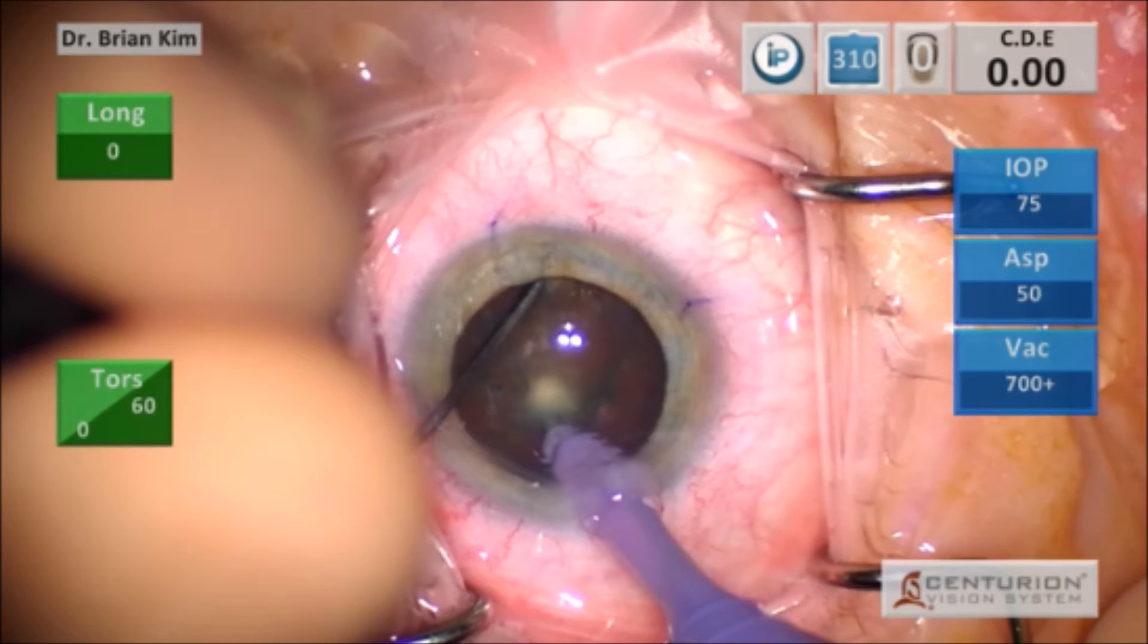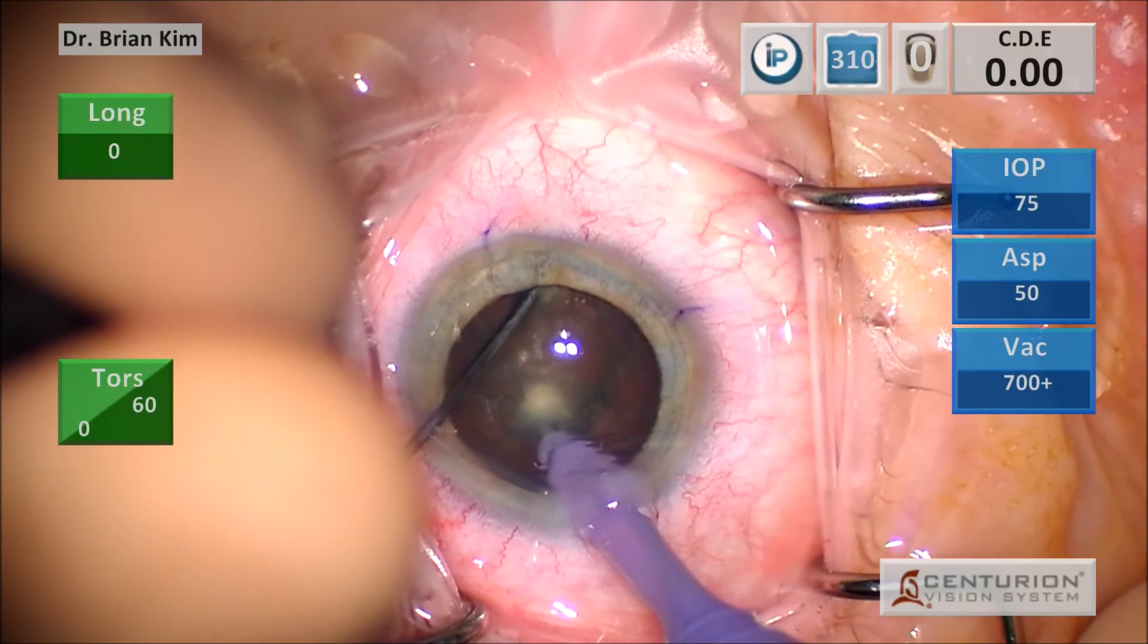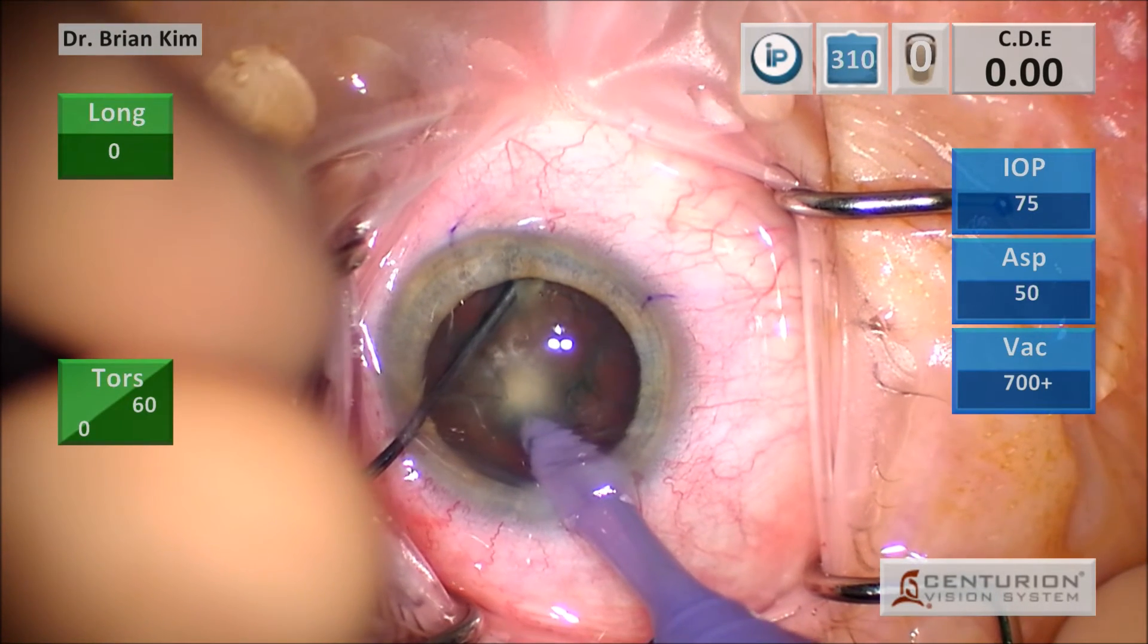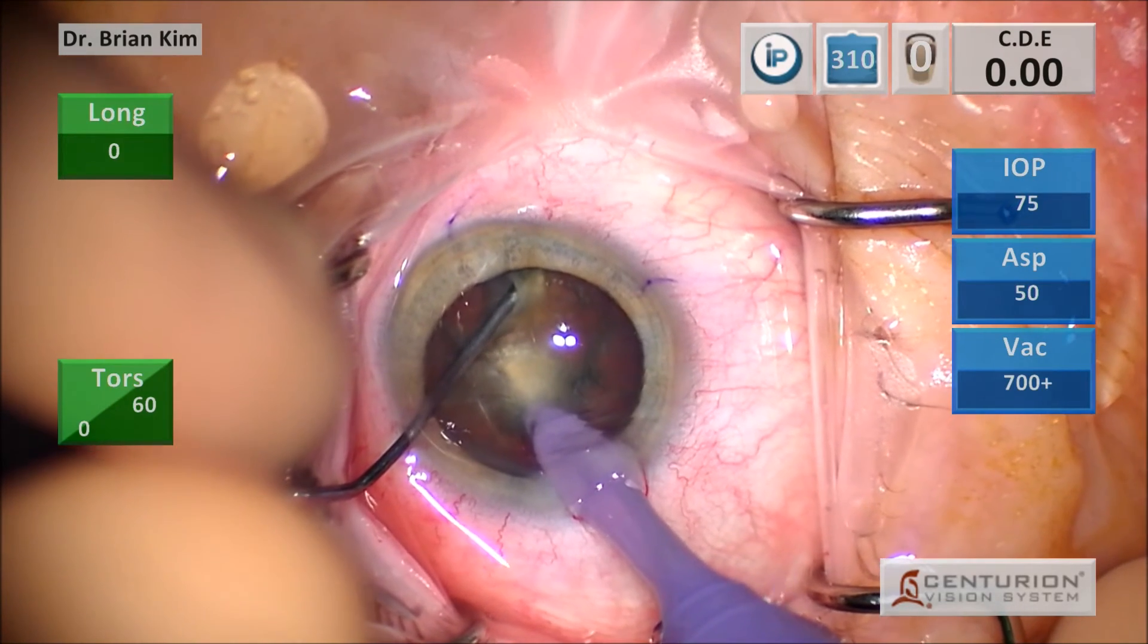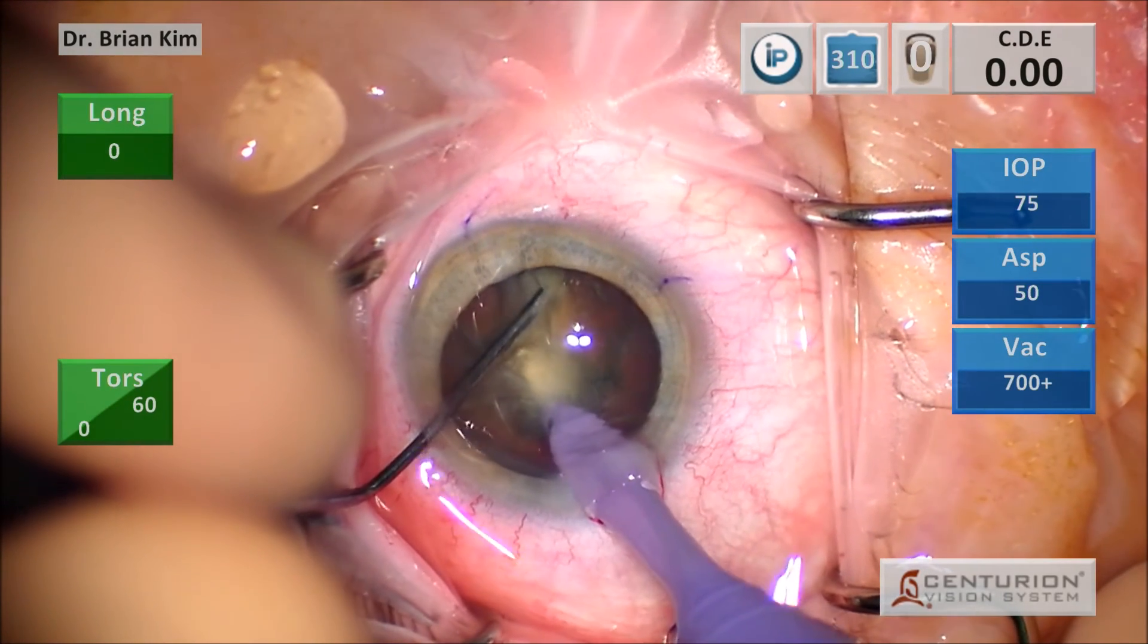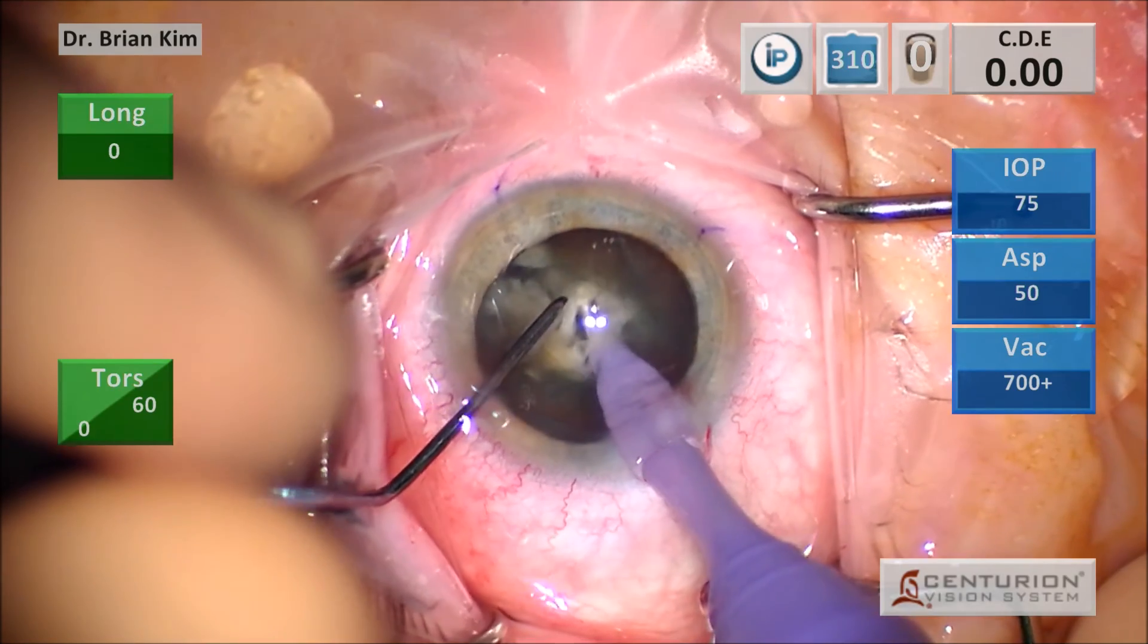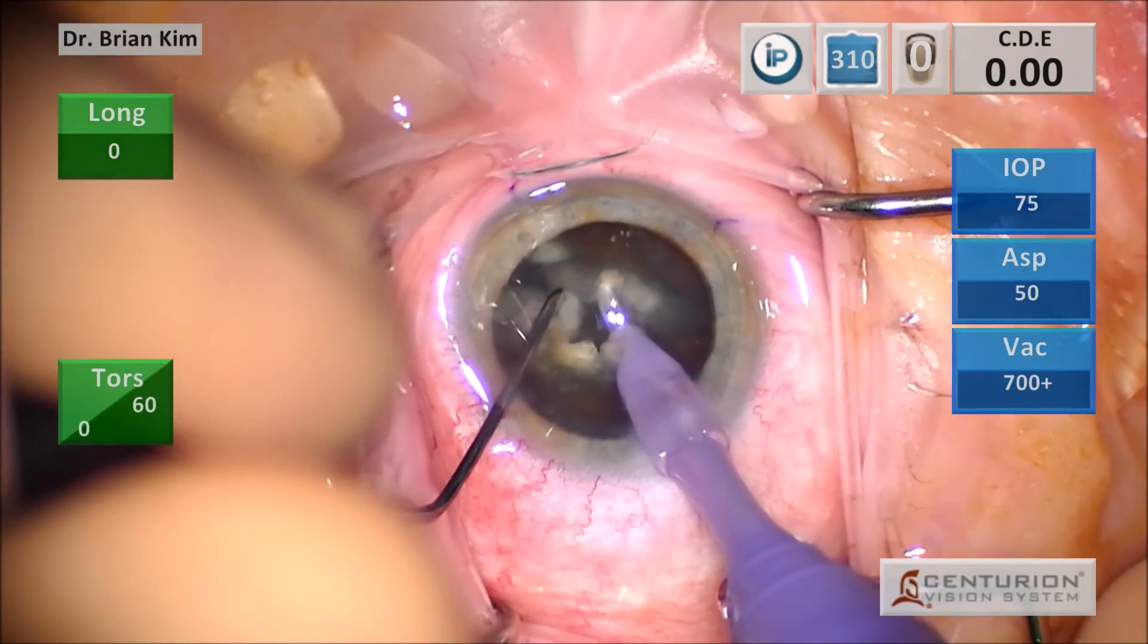So again, you can see the whitening of the lens fibers just anterior to the phaco tip as I'm getting that phaco tip in position for the double chop maneuver. As I bring both instruments to the center, you can see that whitening of the fibers is increasing. Again, this is all mechanical. No phaco or vacuum is applied, and then the lens is fractured.